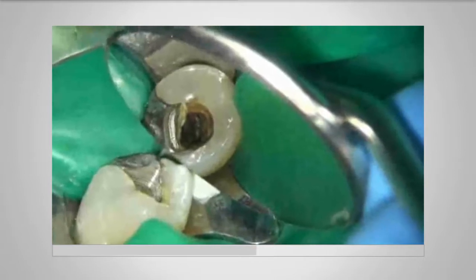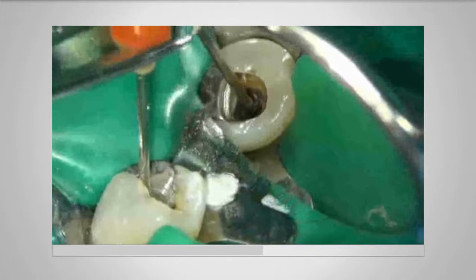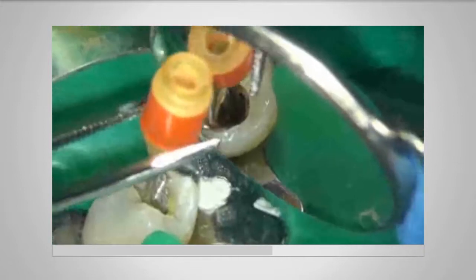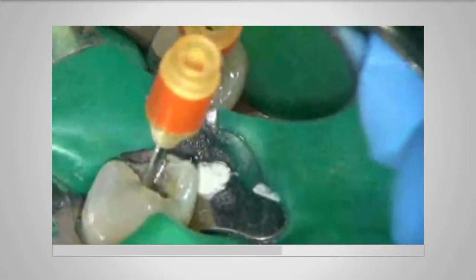And here is the IRS system. This is the tube. I tend to hold it in a pair of forceps because it's easier then to visualize where you're working. If you've got big fat fingers in the way, you can't see it going over the head of the instrument. Now then I insert the rod, excuse my fingers, and the screw thread runs anti-clockwise.